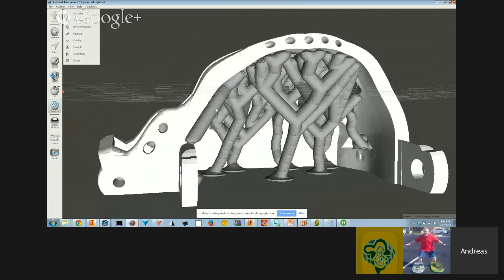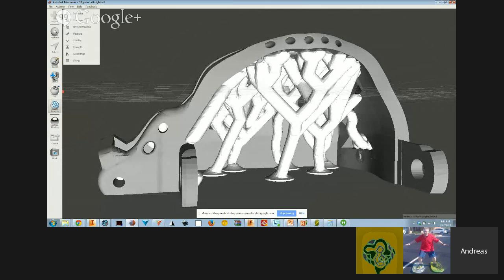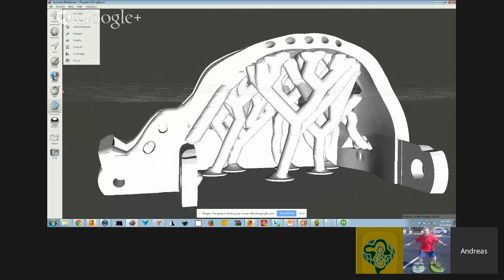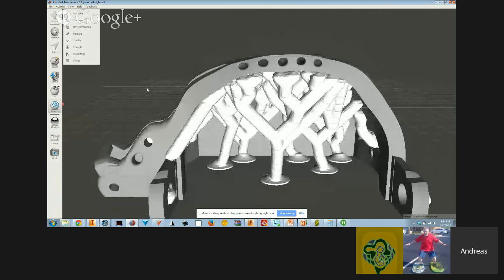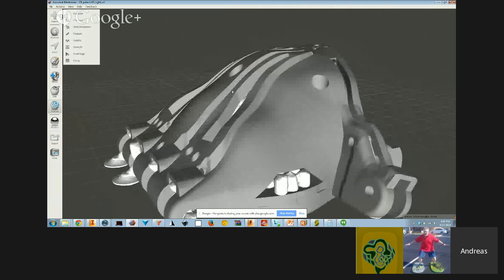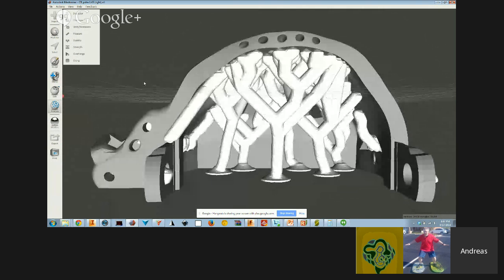And there you have your object and your support. They're separate objects. You can export these. If you want to export them from here, make sure you have them both selected, because it will export the selection. You can do this in the print screen as well, but we don't have the make solid option in the print screen, so it's nice to do it in the Meshmixer screen. So that's it from me. If there are any more questions, shoot. What is voxelization?